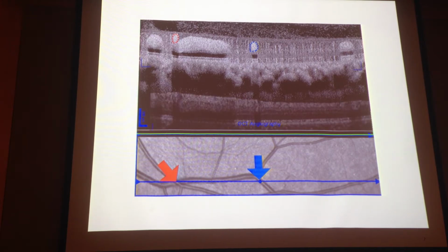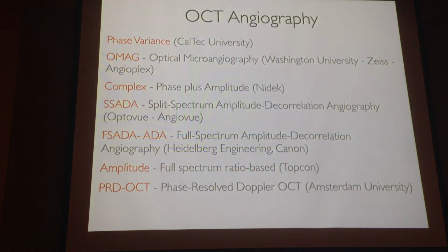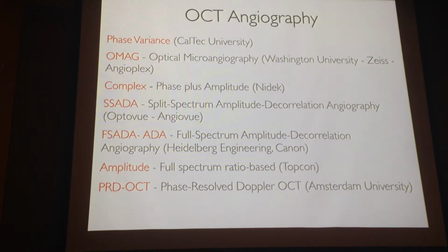The other thing is that when we speak about OCT angiography, we actually mean, as Michel told us before, a series of instruments. And this makes it a little bit more difficult, because when we speak about fluorescein angiography or ICG, we probably consider 2 possibilities: the regular fundus camera and the scanning laser. Here we actually have different things.